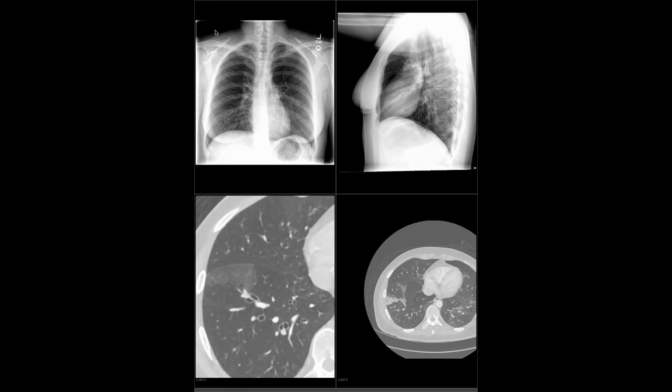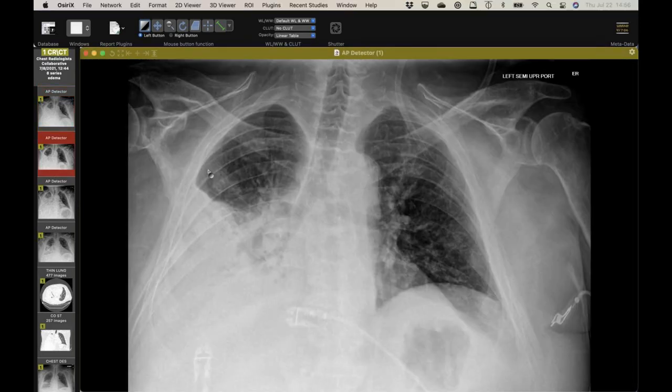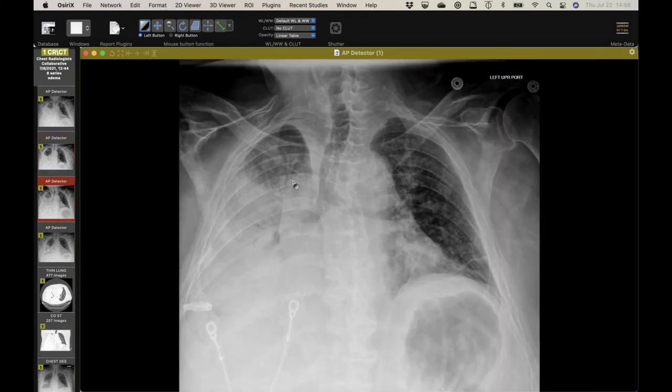Okay, cool. All right, I have a few I can show. So this is a patient who came in short of breath, and you can see there's a large pleural effusion on the right, and they shortly thereafter did another radiograph. They did a little bit of thoracentesis. You see it's improved slightly. And then this is 2 days later, and you can see that aeration of the lung had worsened.